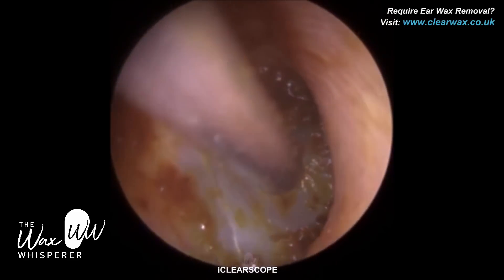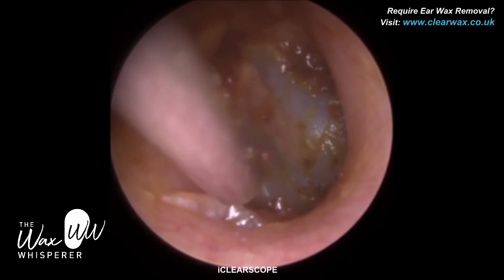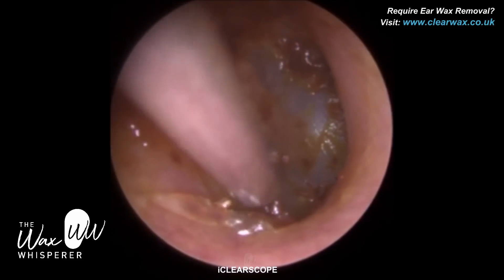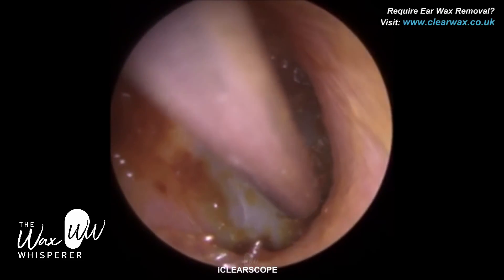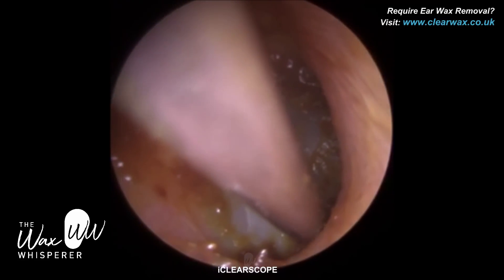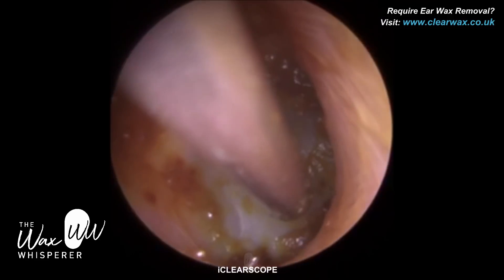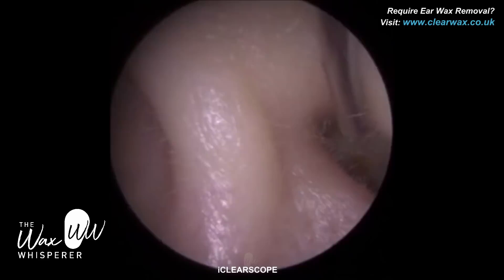You'll see the size difference when I put them side by side on the table — that's the last image, so keep watching. I'm also going to perform the procedure on the left ear. Using a fine end gauge, I'm just delicately removing wax now from the inferior recess and the anterior recess as well. These are little trenches — recesses near the eardrum.